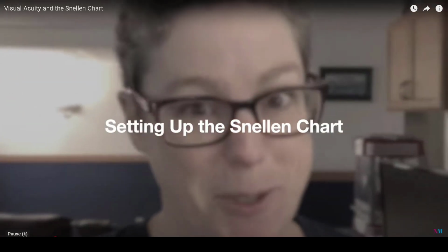Establish a place to put your Snellen chart; you need to have 20 feet. That wall over there, we've had to come down into my basement here to set this up. I'm going to be putting up the Snellen chart and demonstrating how to use it next.